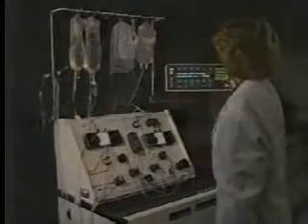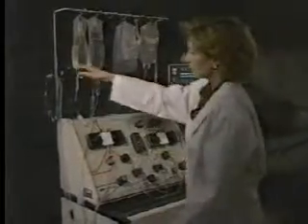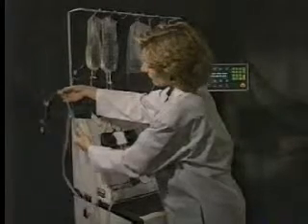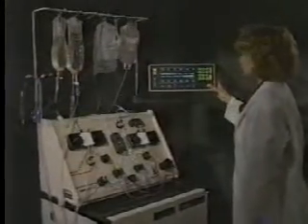Press the continue key. The system instructs you to close the saline line and clamp the access line at the access manifold. Ensure that the access line is still clamped, then close the roller clamp on the green striped access saline line and press the continue key.